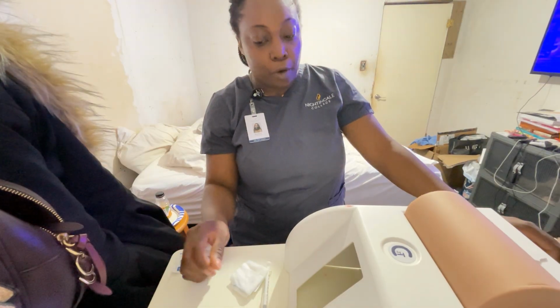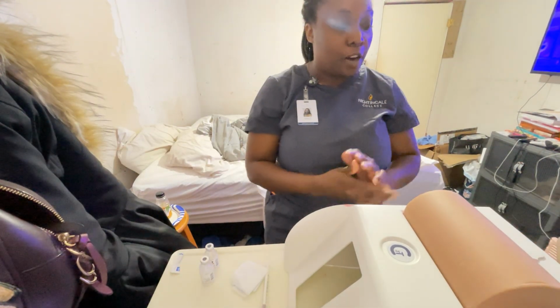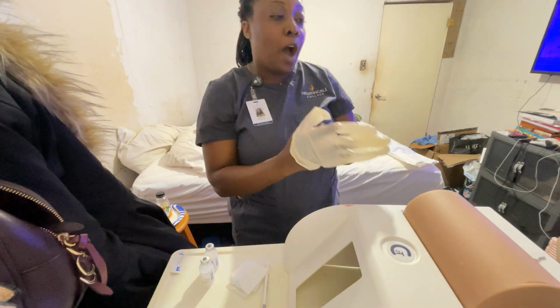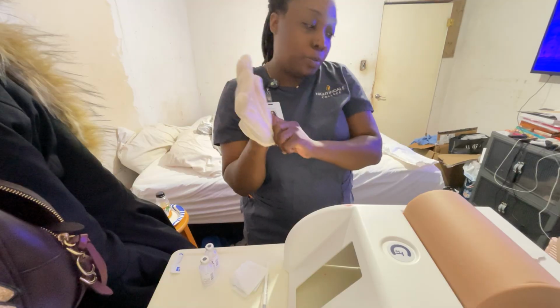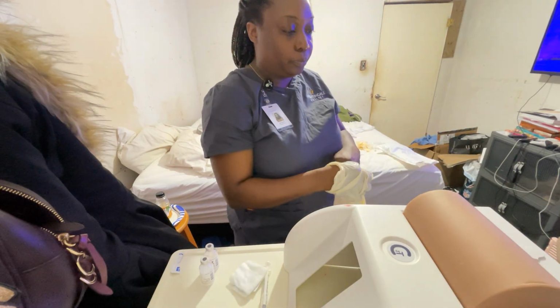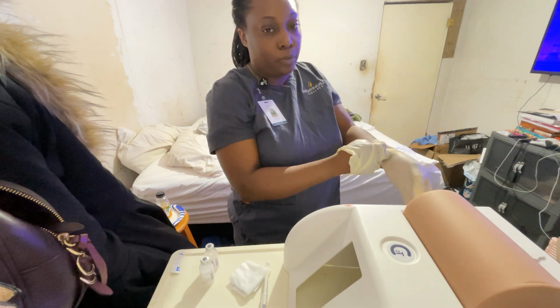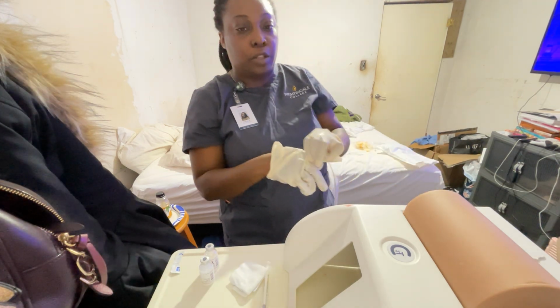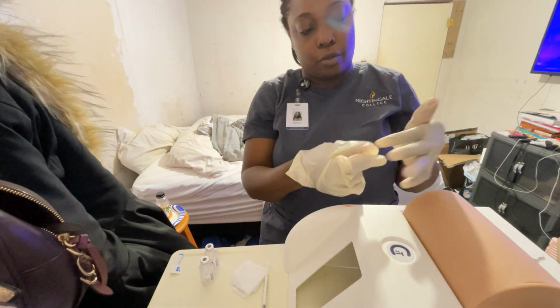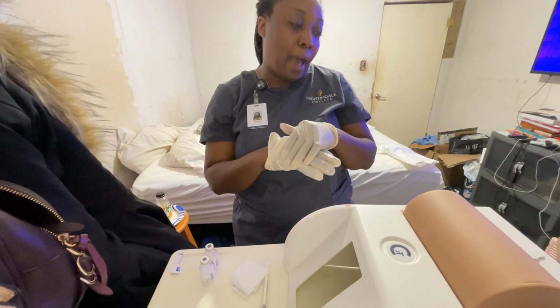All right, so we're going to go ahead and get started. I'm going to put some gloves on. Are you okay with me checking your blood sugar this morning? Okay. Take your index finger, check it, squeeze it out. Okay, Ms. Jane, so your blood sugar is a bit high.